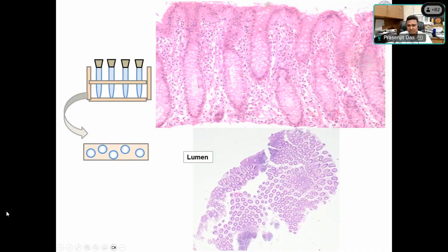What we actually see, first we have to see if there is orientation or not. When the biopsy is oriented properly, this is an oriented biopsy. So what is the finding? As she has very nicely told, the crypts are evenly distributed. When it is oriented, you will see the tall, very deep crypts, and the crypts usually pinch on the muscularis mucosae. The whole part is the mucosa, and the spaces in between the crypts are usually equal to each other, so that we compare this arrangement with test tubes evenly kept on a rack.